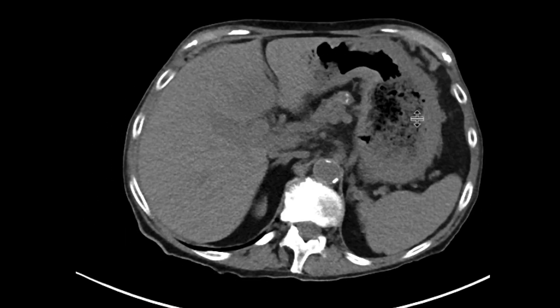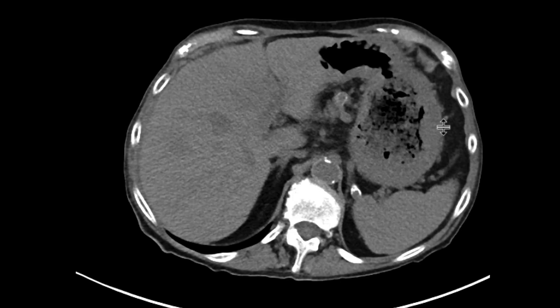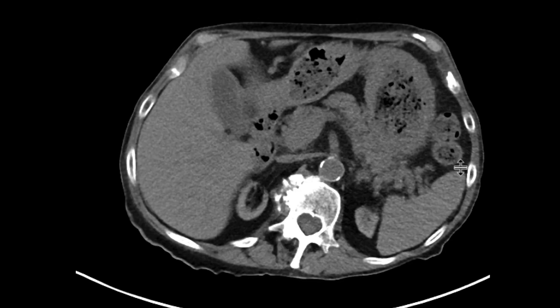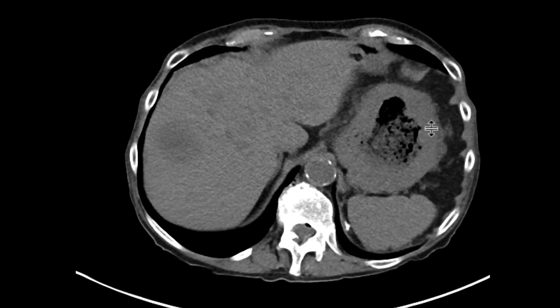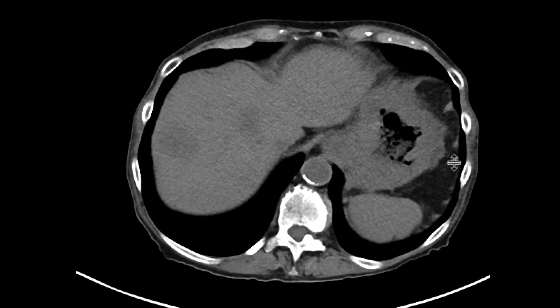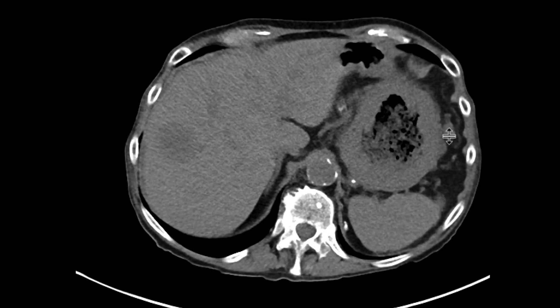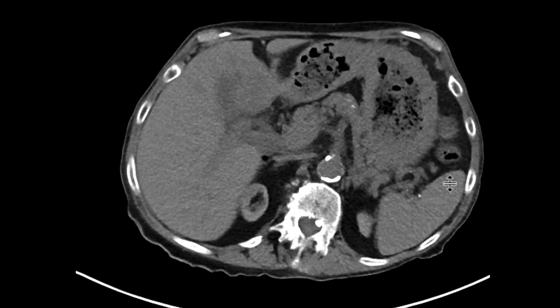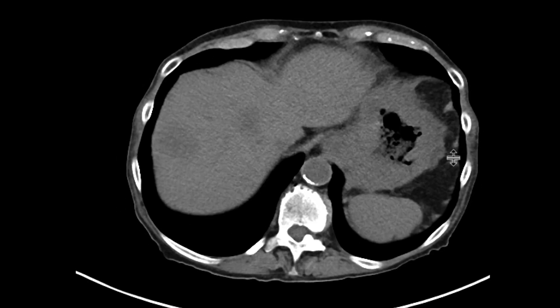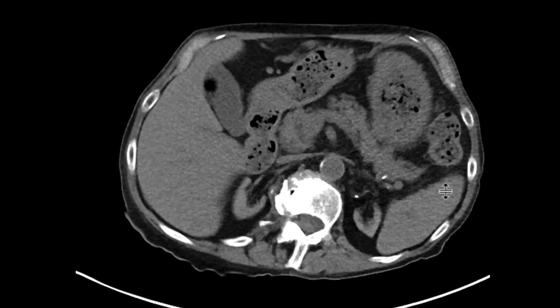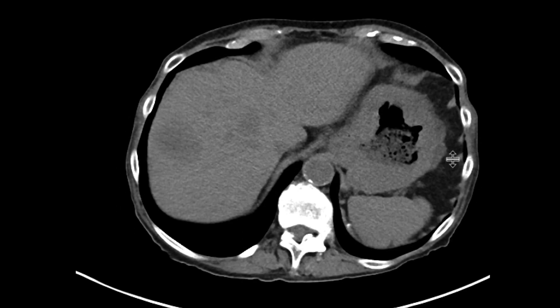The other finding we can see in this patient — more subtle, but it's there — is that the gastric wall is way, way too thick. The stomach is reasonably distended and that gastric wall is thick and looks lobulated. We can start to see that there are a few nodules adjacent to it, which are probably going to be lymph nodes. These findings are highly concerning for a gastric mass with multiple liver masses as well.